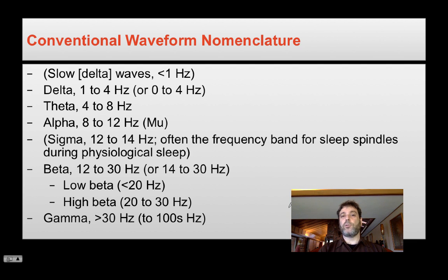First, I want to refresh your memory about the nomenclature for the waveforms that make up the electroencephalogram. I remember it by the mnemonic "get battered," from gamma through beta, then alpha, theta, and then delta. Importantly, in terms of general anesthesia, the gamma waves are typically not well perceived because they're attenuated by the skull. However, with electrocorticography, you can see gamma waves into hundreds of hertz.